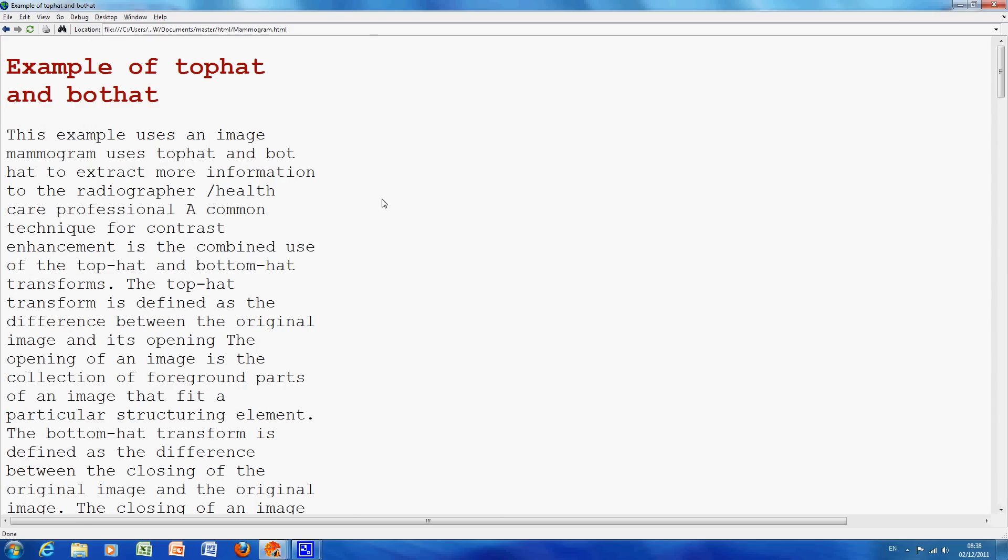As I mentioned before, we're using TopHat and BotHat. And what TopHat does is in one sentence it finds the intensity peaks, that's the white bits, and the BotHat in one sentence finds the intensity troughs, the dark bits. So that's what we're trying to do.